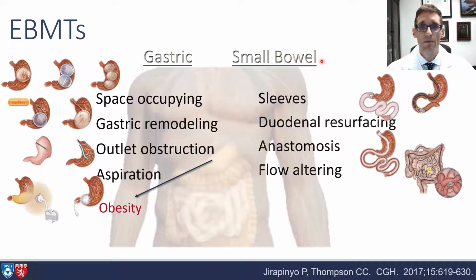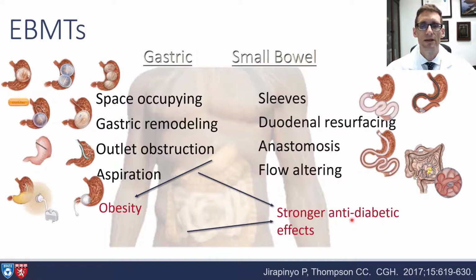And then our small bowel therapies, which include various liners, duodenal mucosa resurfacing, and anastomotic technologies. And these are thought to have very direct metabolic effects with a smaller amount of weight loss.